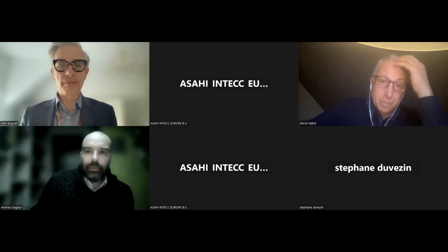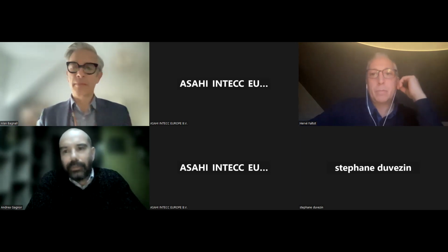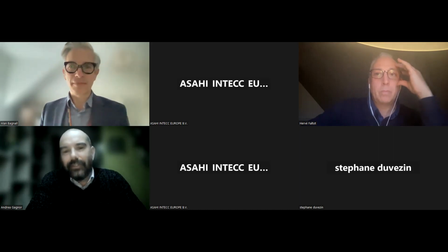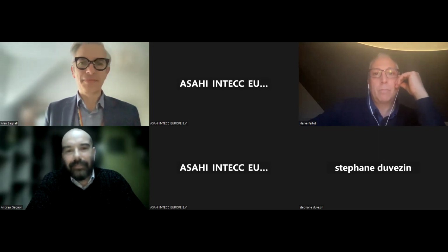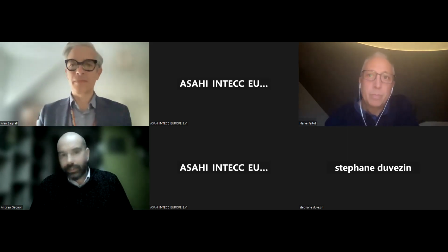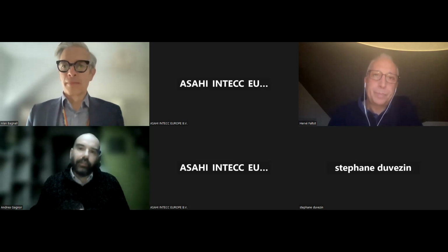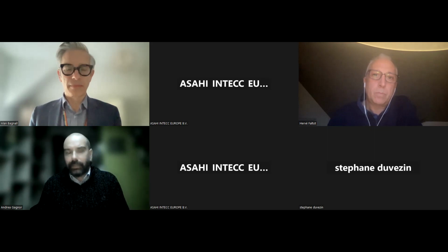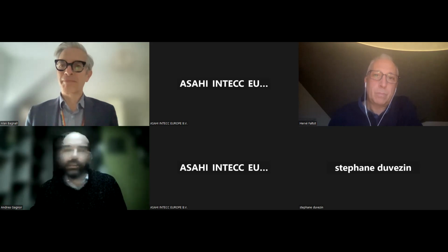So just a couple of answers before asking me as a last question. First of all, the difference between Samurai wire and the coating of Sion. Do you really feel any difference? Do you have the perception that they are different in terms of torque control or not? From my point of view, there is some difference, and the kind of feeling, the kind of control that you have with the Sion is still not reached by other technology developed by other companies. But this is a personal view and a personal perception. What about your ideas?